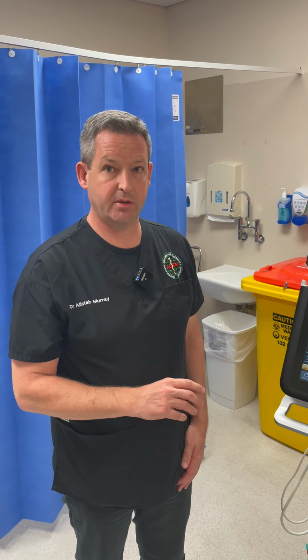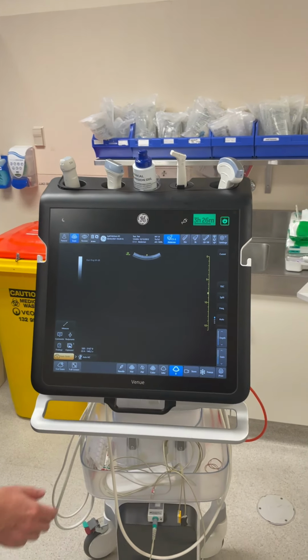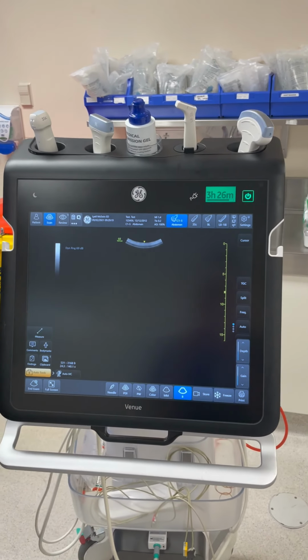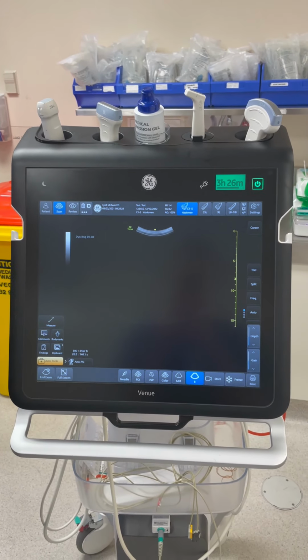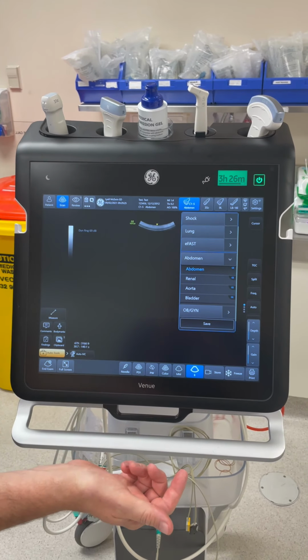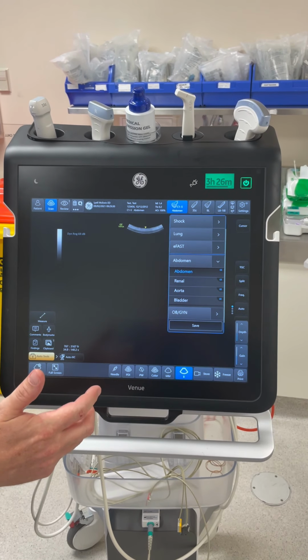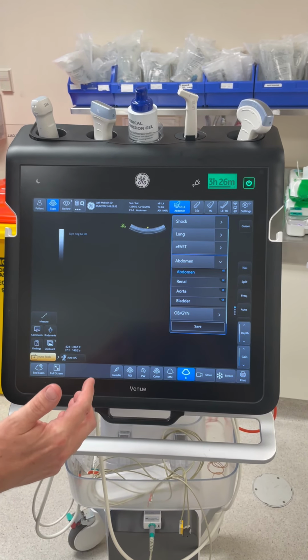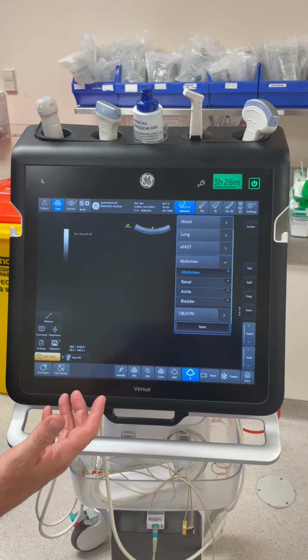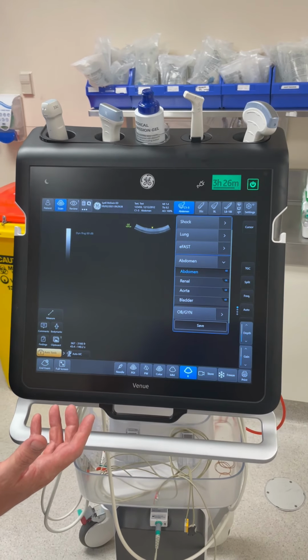Okay, just going to talk you through how you select transducers on the GE so you can perform your examination. We've entered our patient data and the fact that we are the user who's performing the examination. We're going to start by pressing the transducer that we want, and in this we've got various different defaults on your transducers of your presets that can help both with image optimization, some of the automatic calculation tools and some of the labeling as well.